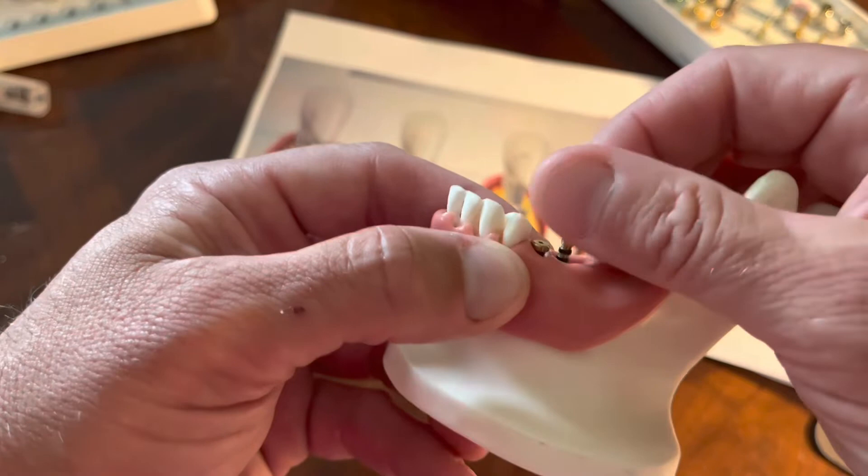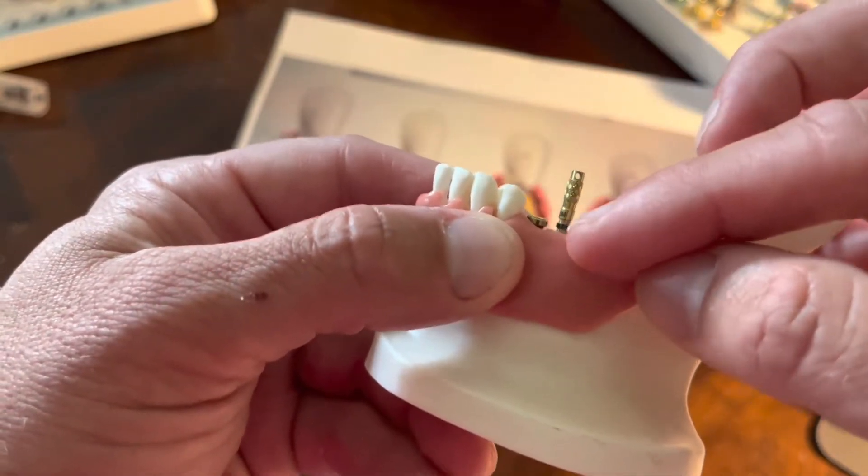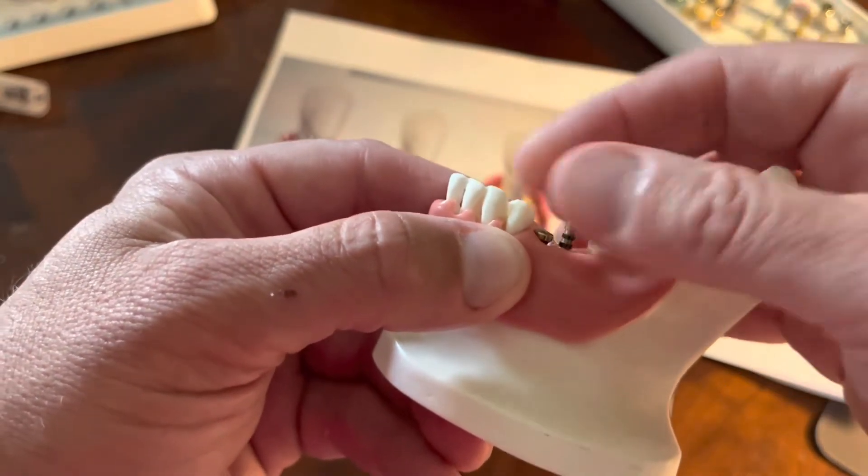During surgery it helps to get the optimal height, and then you check your diameter for your healing abutment. But during the restoration, we obviously want to see on the buccal and then hide the margin below for aesthetics.